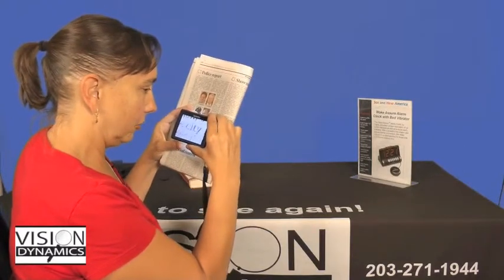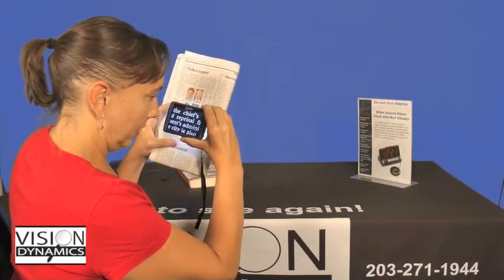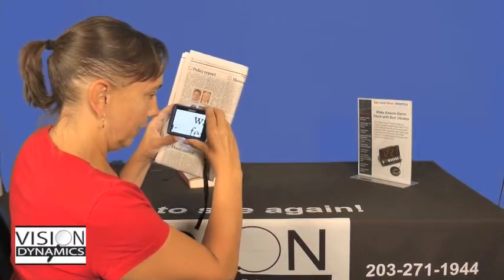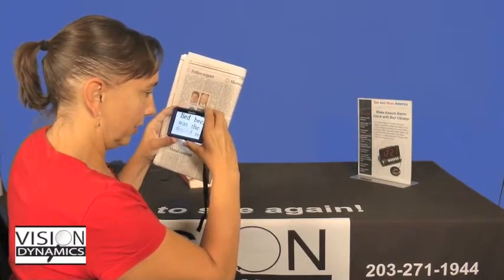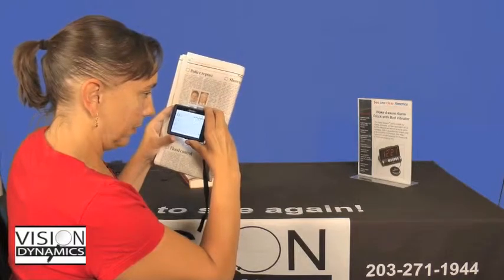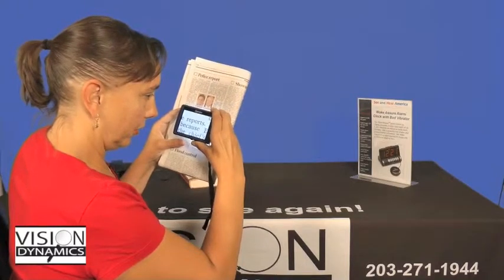And again, I can change my color combinations by pressing that bottom button where my thumb is. And then I can also change the size of the print by rocking the button. I'm at the largest. Pushing it to the left twice makes the print smaller. And now one swing to the right makes it a little larger. And one more makes it the largest.